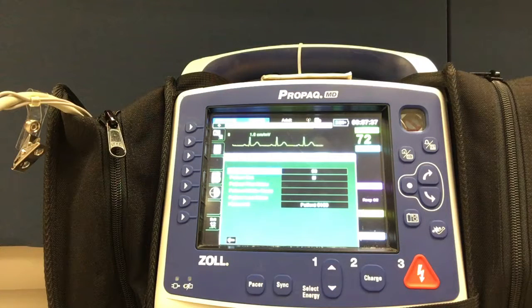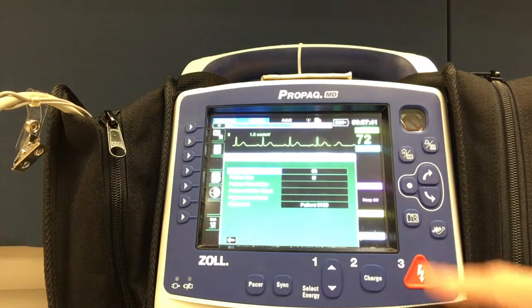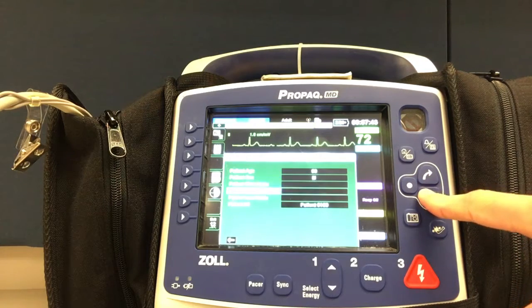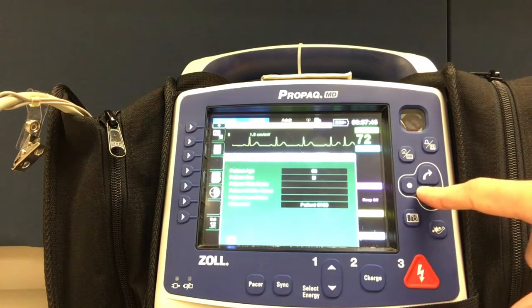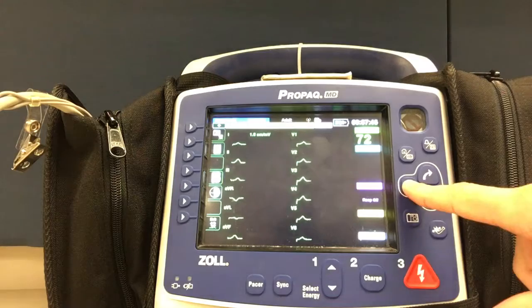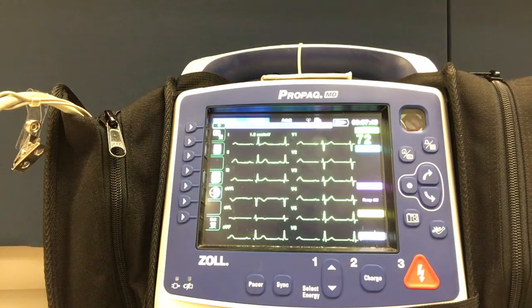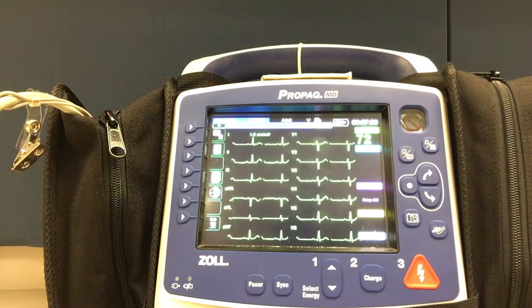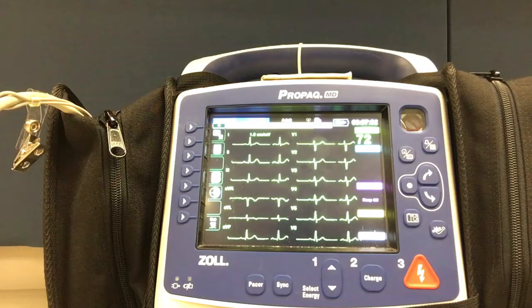Demographics asks for age, sex, and name. After demographics have been entered, press the button to the left that depicts a camera.